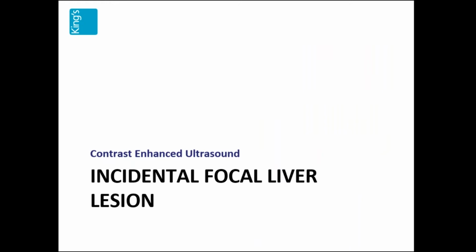Now, what about the incidental focal liver lesion? Now, we're talking about a lesion that when you're doing your ultrasound examination, you find a lesion in a patient that has no other risk factors, but has come to you because of vague symptoms like upper abdominal pain, or they've had a blood test with their primary care physician, which shows some abnormal liver function test, or very often it's for something completely different that they've come and you've been looking at the liver.